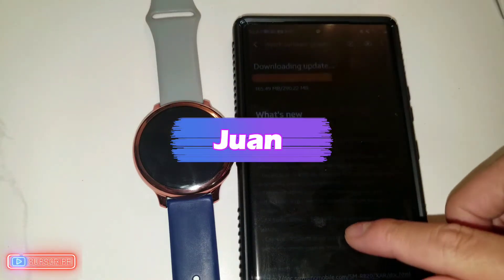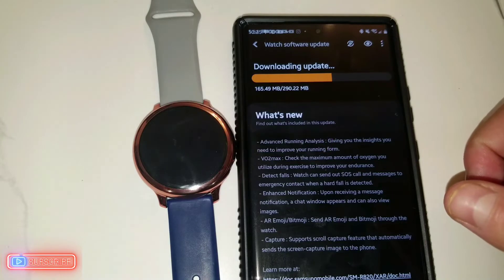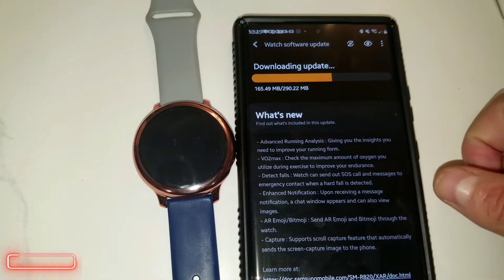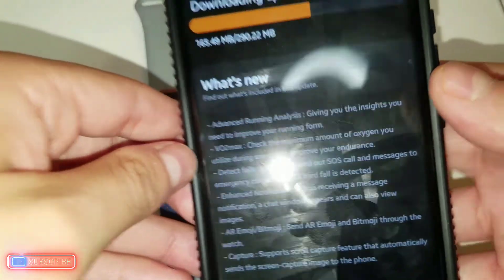Welcome back to another video. Today I'm going to be showing you the brand new update on the Galaxy Watch Active 2 — and as you can see, it's 165.49 MB for this update.